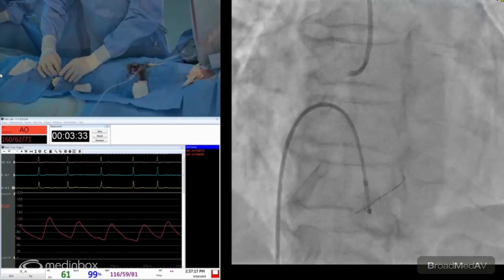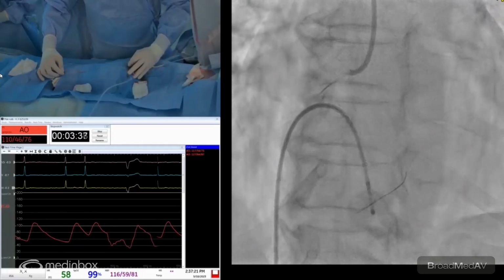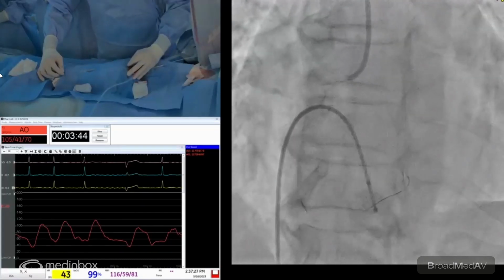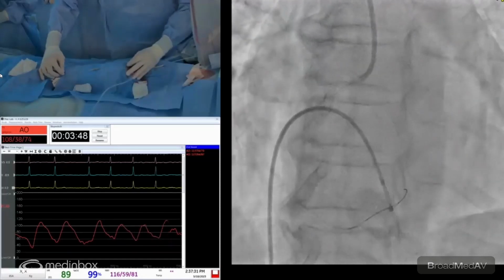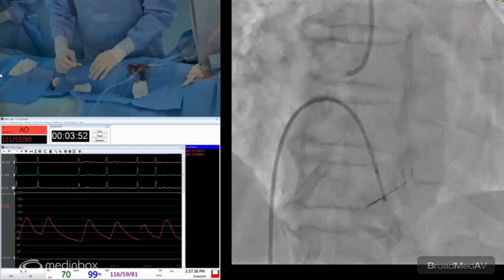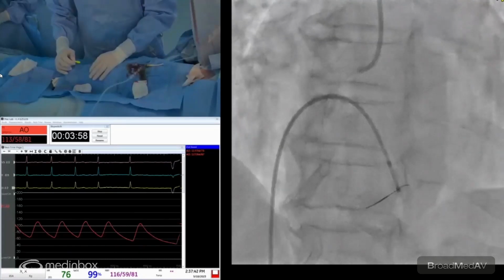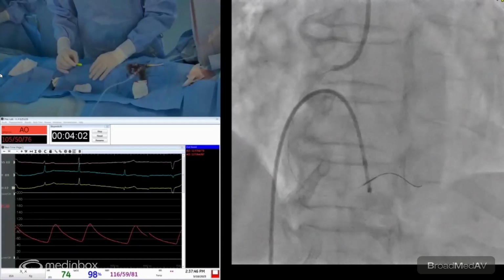So here we use a Turnpike as a microcatheter. Here we go. We're just going to cross the lesion with the Turnpike, and then we're going to remove the workhorse. So it depends how severe the lesion is. If it's not very, very severe, you can just deliver it like you're delivering a tube, like I did right now. If you're dealing with a subtotal lesion, CTO-like, at that point, then you need to torque the microcatheter to be able to deliver it more distally.